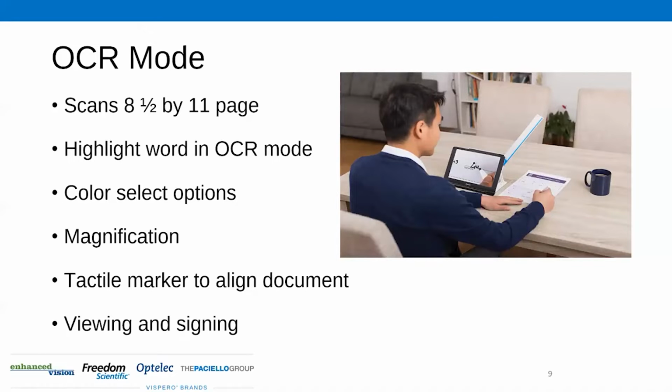And if you want to use it, while this device only has, let's say, 22x, I think, of maximum magnification, you might look at a desktop magnifier and say, well, that has 60 or 70x. But a unique feature of this device is you can actually mirrorcast the image to a television. So you could almost imagine this as if you're using it at home and you're an avid reader and you're generally doing a lot of reading and you want the performance of a desktop, you could easily use this as your camera, your capturing device of the text, and throw wirelessly the image to a monitor or a TV that could be directly in front of you.